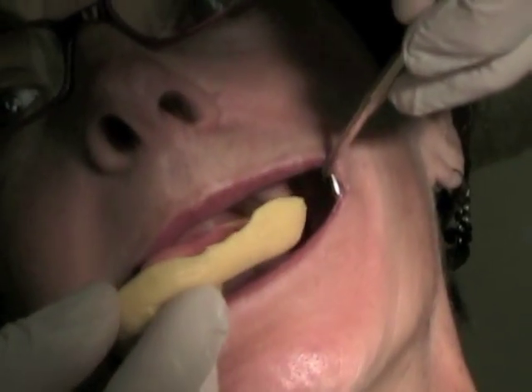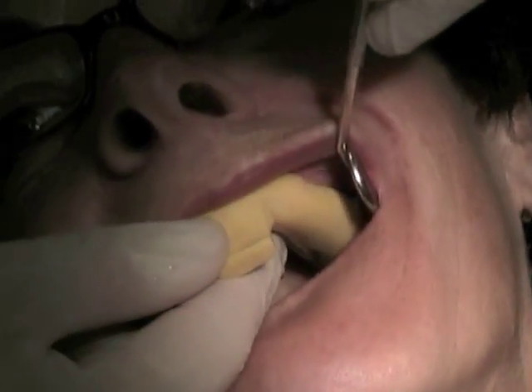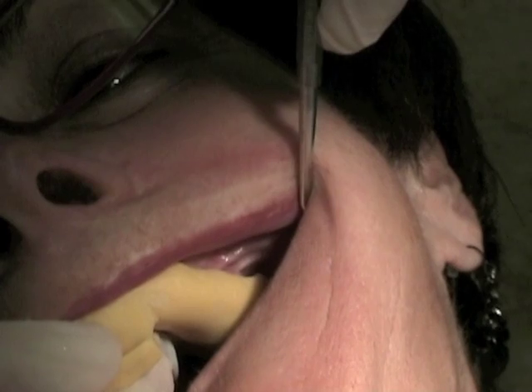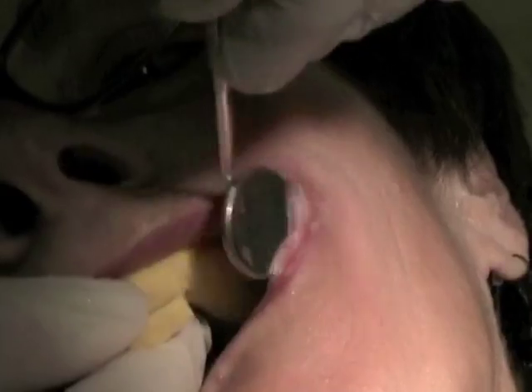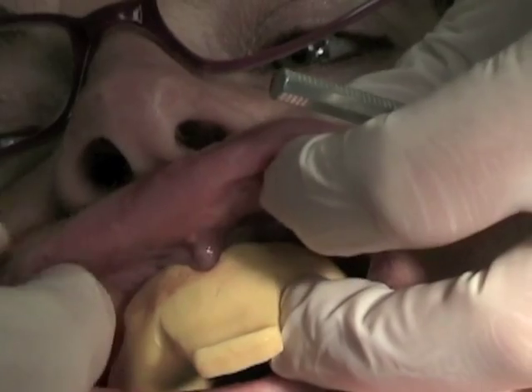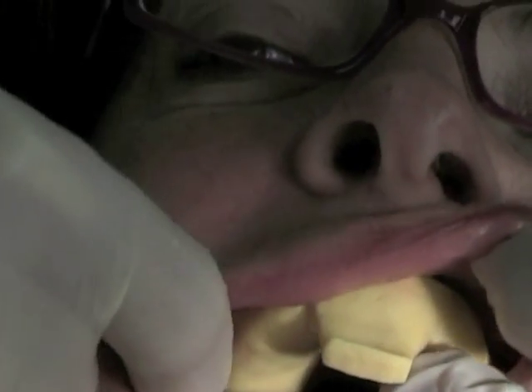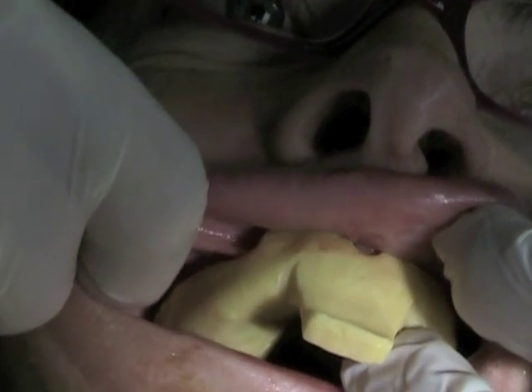When you try the tray interorally, insert it sideways and rotate it into proper position. You'll find this technique makes placement of the tray or dentures much easier. The edges of the flanges should not touch the peripheral roll of the vestibule — check for clearance. Check both the buccal and labial frena to ensure no contact during function. Pull on the lips and cheeks to simulate function and ensure proper clearance. The tray should not displace from the tissues while you manipulate them; if it does, shorten or thin the flange.